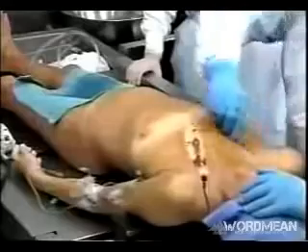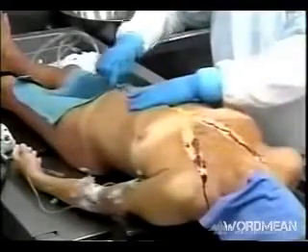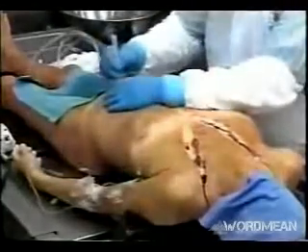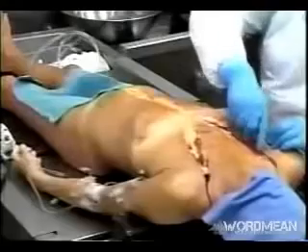The assistant's going to make the first incision. In any autopsy, the classical way of beginning it is by making a Y-shaped incision, starting on the chest and then extending downwards to the pubic area. This allows full exposure of the various body cavities while still maintaining a procedure which allows for an open casket funeral if that's what the family desires.